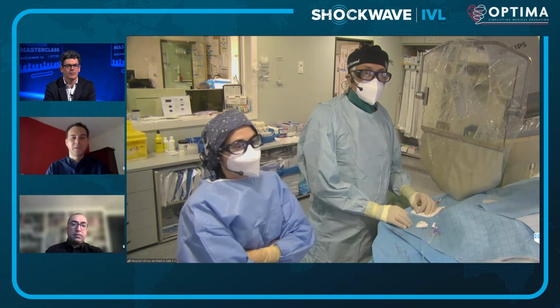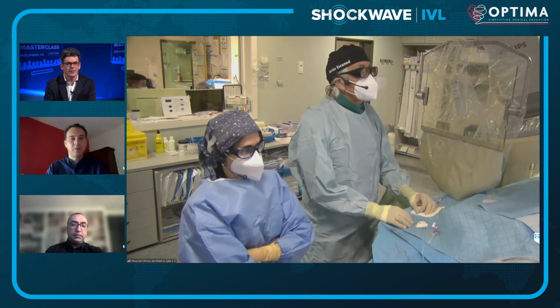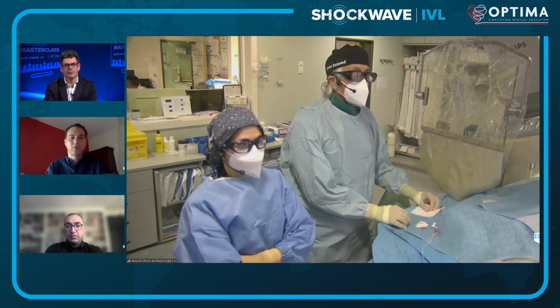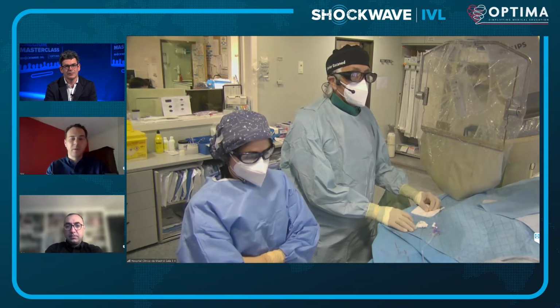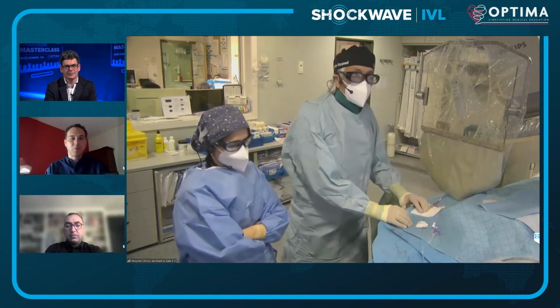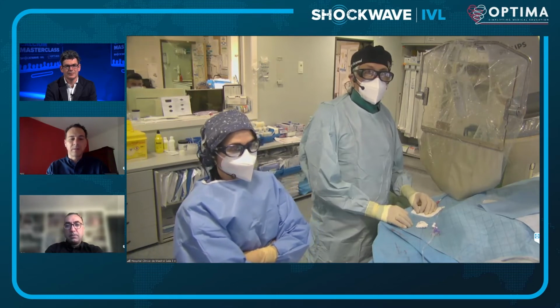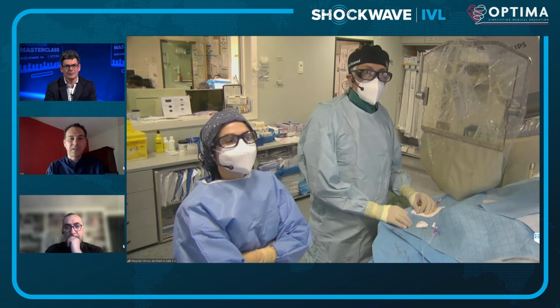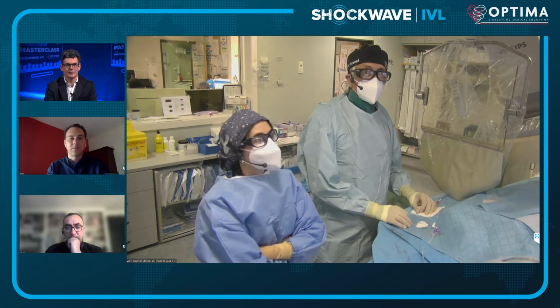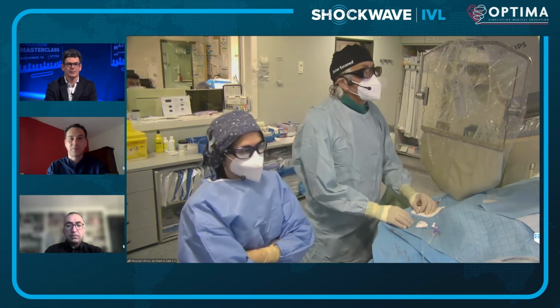Yeah, good question. Despite the fact that this is a large vessel and the angiogram is obvious, in IVUS or OCT we are going to look for the angle of the calcium. If it's more than 180 degrees, it's going to be more efficient with shockwave. If the calcium is deeper, it's also going to be more efficient, and it's very often the case in post-CABG patients. And also the thickness of the calcium, which we can appreciate very well in OCT and also with IVUS. So these three factors are key to select, as much as possible, the good patient.